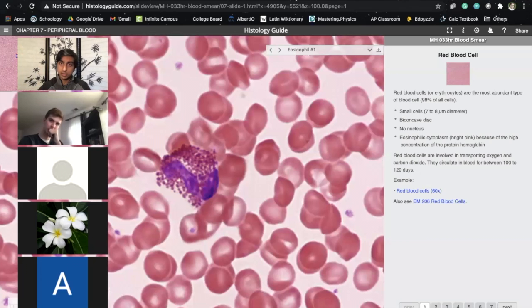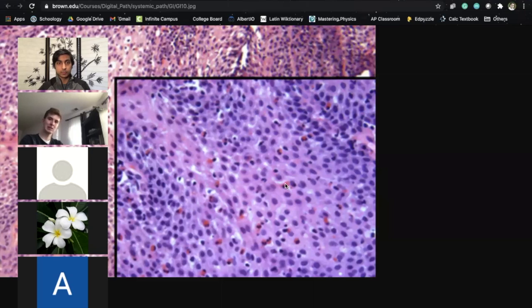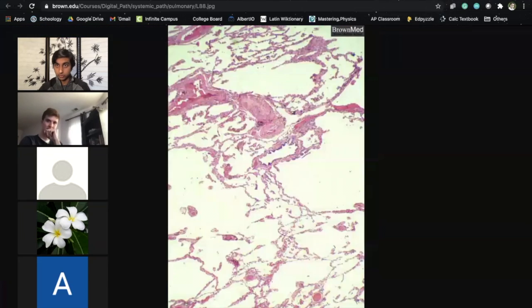And when we saw, let me, if I can find that again. When we saw these pink things here, right? You'll notice that the scaling is very different. It's much more zoomed out, and so that's why you don't note the individual little granulocytes, but you do understand that where there's a large amount of protein, you have a large amount of that pink acidophilic dye binding. And again, I know these are different slides, but the dyes that are used are relatively standard, at least for the purple and the pink that we're looking at. There's another one that we'll show at the end as well.